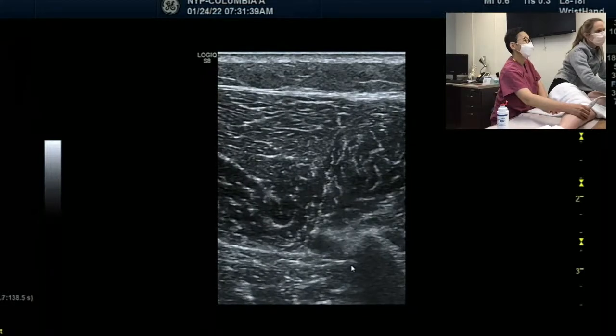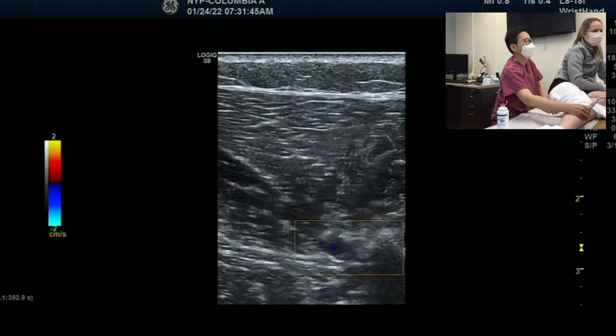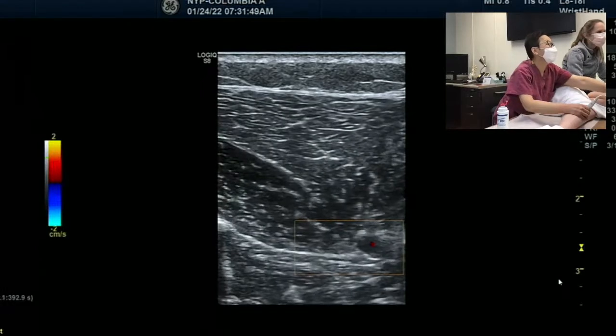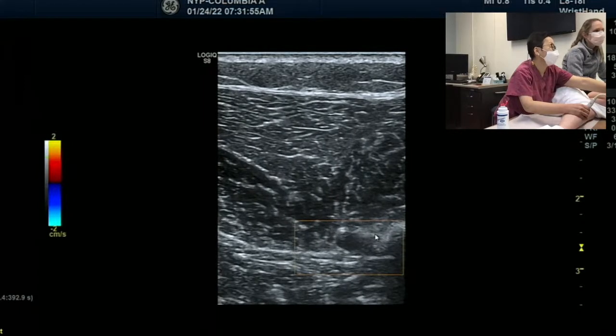Can you put the color flow on one more time? That's the anterior tibial artery. And then, this is the anterior tibial nerve, the deep peroneal nerve.